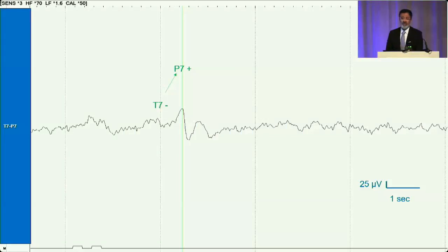So how do you understand what each electrode is doing? Well, first, if you know that in this situation there's an upward deflection happening here, I will call it a pen deflection just from a historical perspective. The analog machine had a pen, and anytime it would deflect upward, what that would mean is, think of it as a graph. You have a graph, positive numbers are on the top, negative numbers are on the bottom, 0 is in the middle, okay?